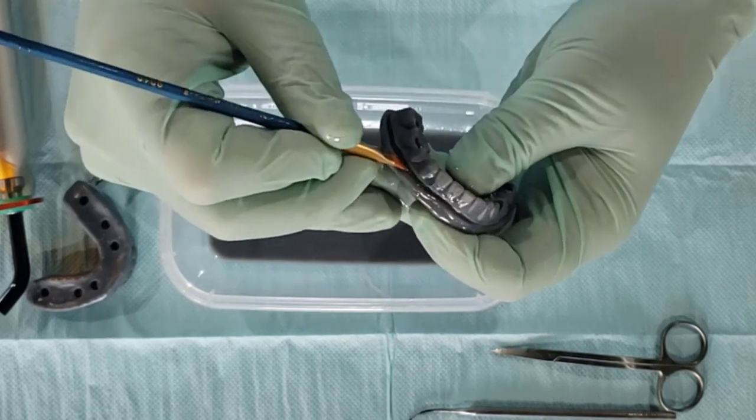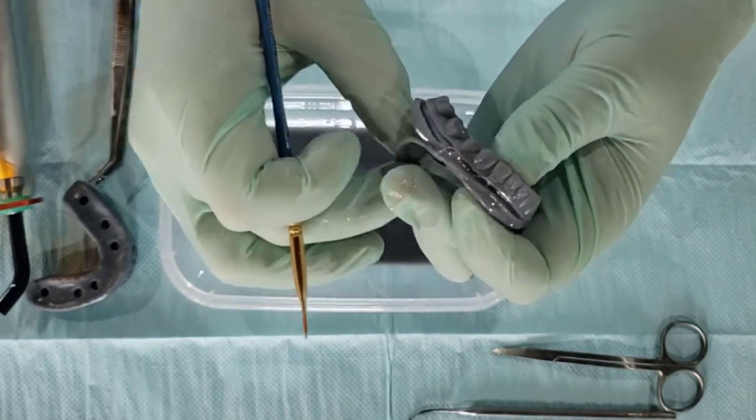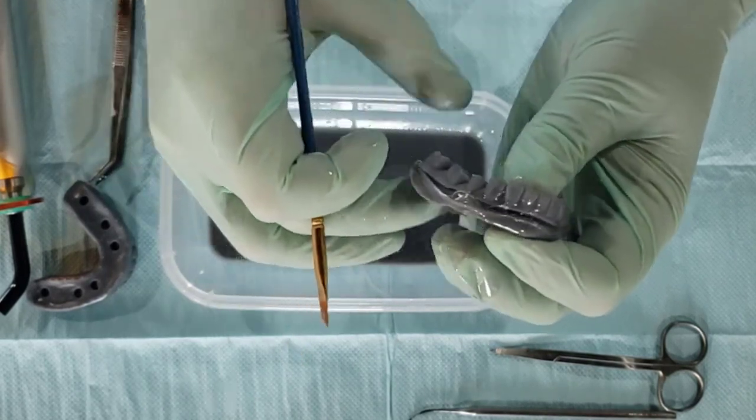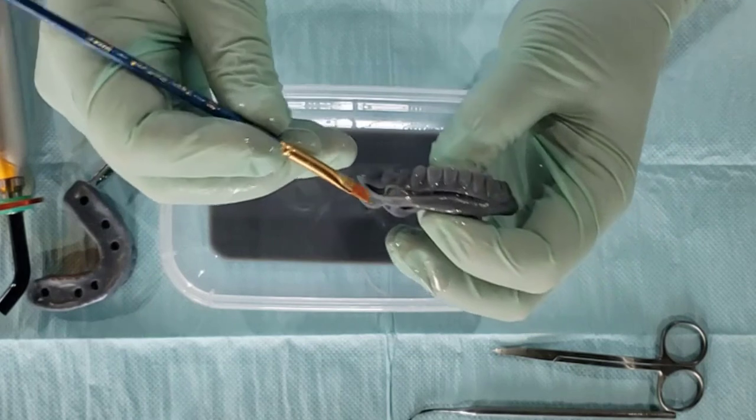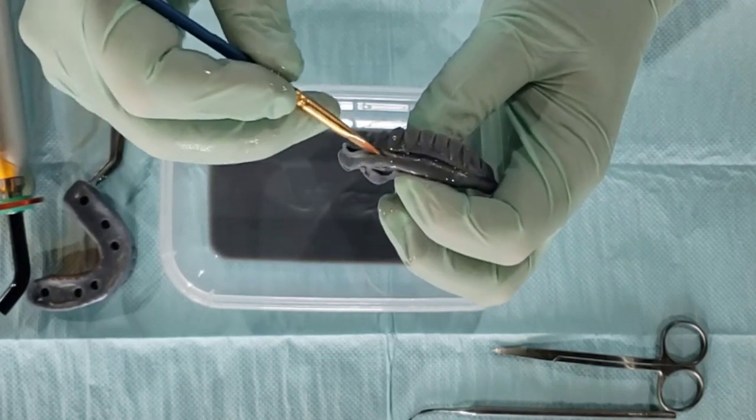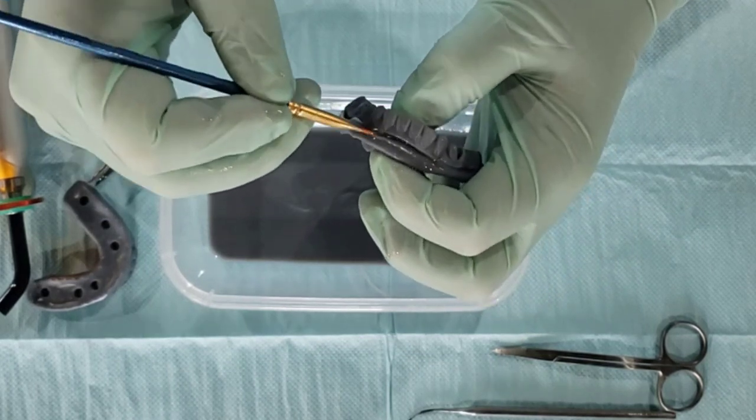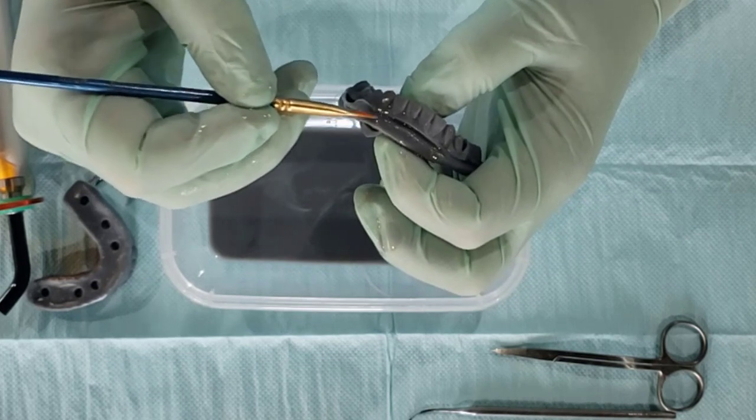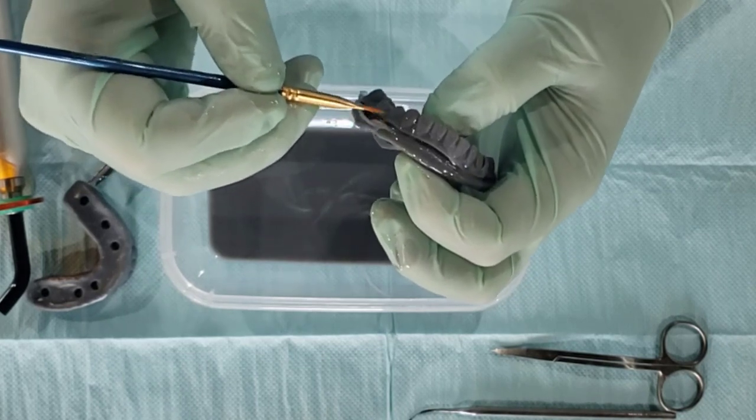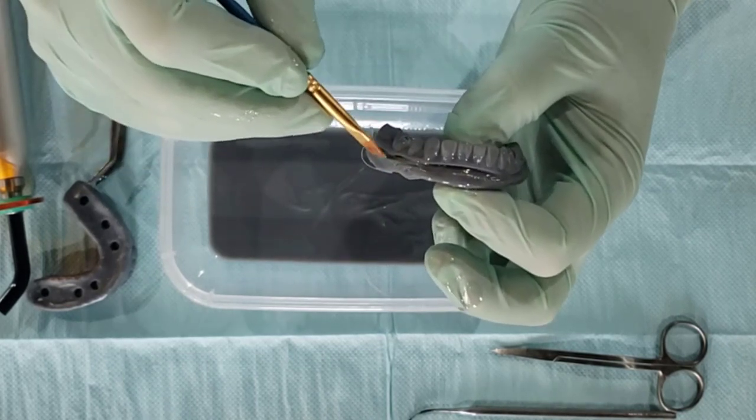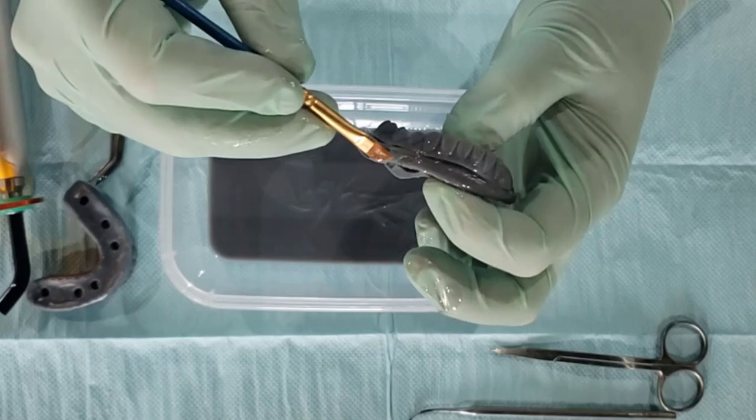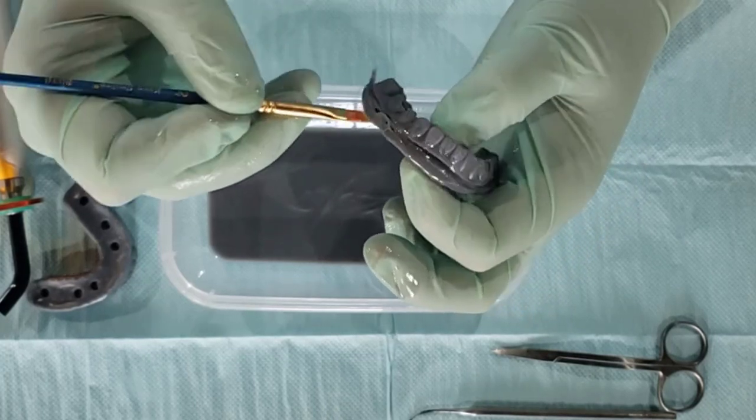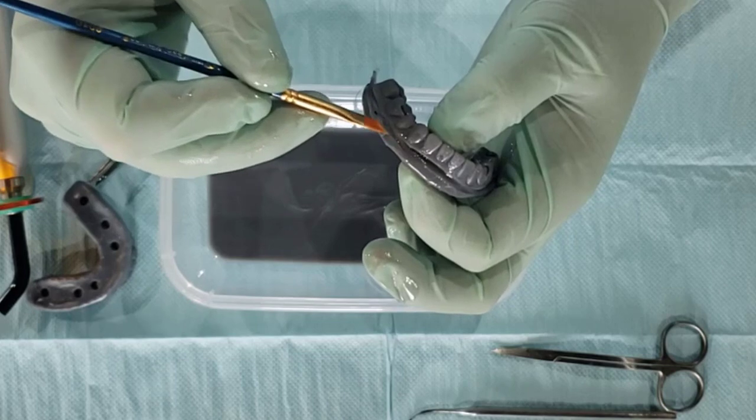You want to make sure that you don't get any of this fiberglass up on the actual teeth, because anything that's exposed to the mouth is going to attract plaque, be rough to the tongue, all of that stuff. So find you some good dental fiberglass when you do this.